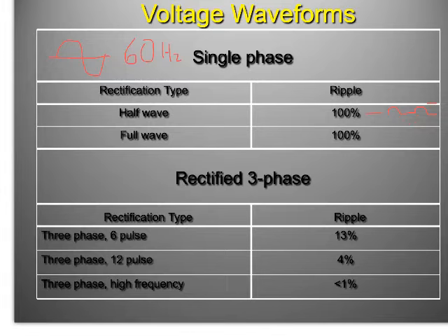One way to think about what I'm talking about right now is like a rainbow. Okay? We all like rainbows, they're pretty. When you turn on the X-ray tube, you are making rainbows, right? You're making a spectrum of energies. Okay? It's my very bad drawing of a rainbow there. Looks sad, I know. When we talk about kilovolt peak, we're saying we're going to set a technique up here, and that's the peak energy. The peak energy of my rainbow, right?